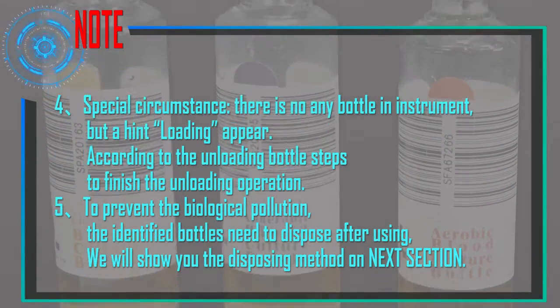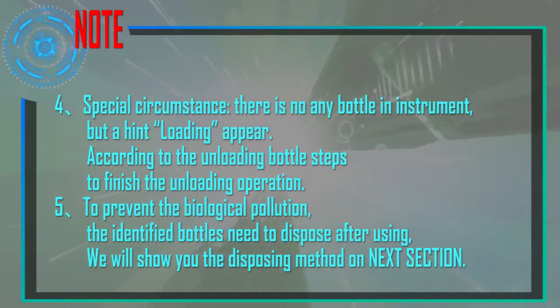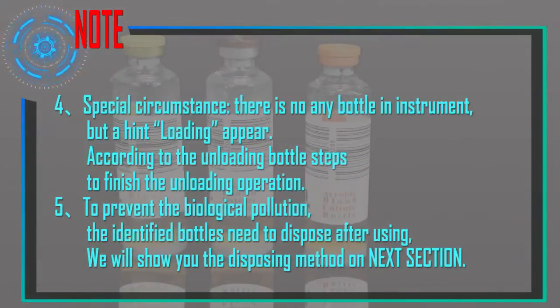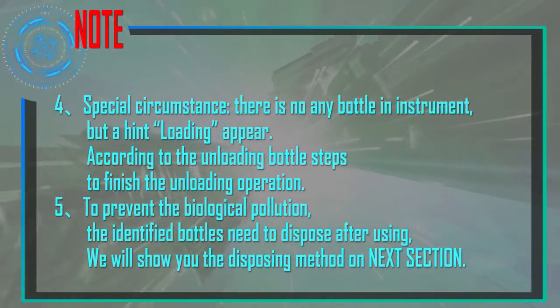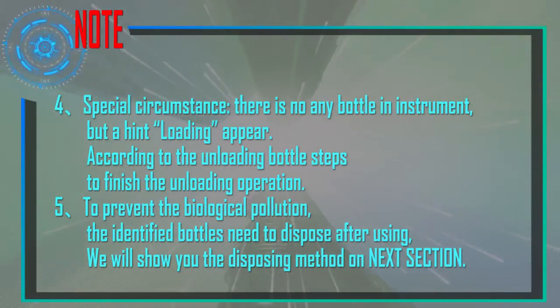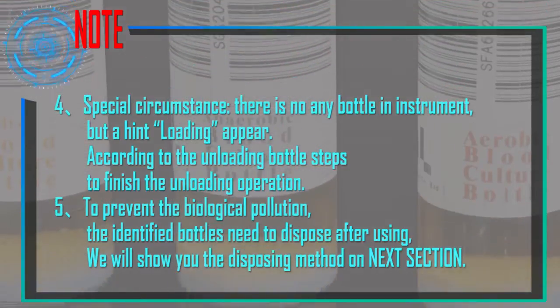Special circumstance: If there is no bottle in the instrument but a loading hint appears, follow the unloading bottle steps to finish the operation. To prevent biological pollution, used identified bottles need to be disposed of after use.